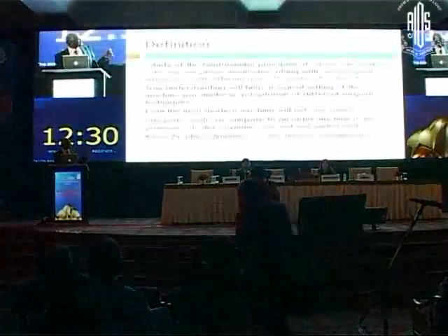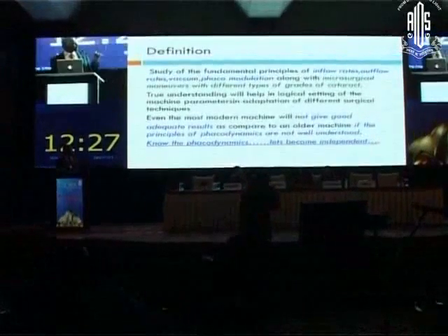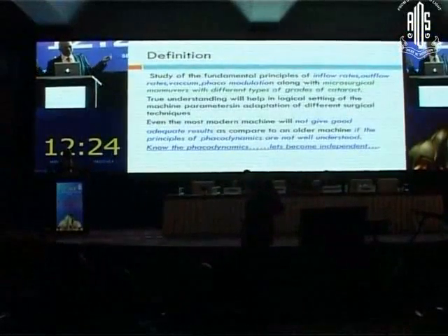As you know, Kelman introduced phaco, and the study of the fundamental principles is very, very important: inflow rate, outflow rate, vacuum, phaco modulation, along with the microsurgical maneuvers with the different grades of cataract. True understanding will help in logical setting of the machine parameters and adaptation of different surgical techniques. Even with the most modern machines, we always feel that the machine is costly.